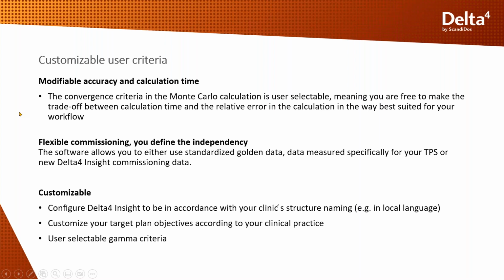Finally, the system should be user-friendly and customizable. The convergence criteria in the Monte Carlo calculation is user selectable. So you are free to make the trade-off between calculation time and relative error in the calculation, so it best suits your workflow.